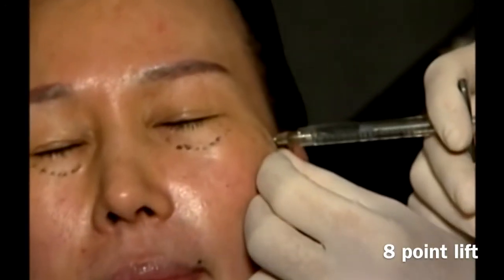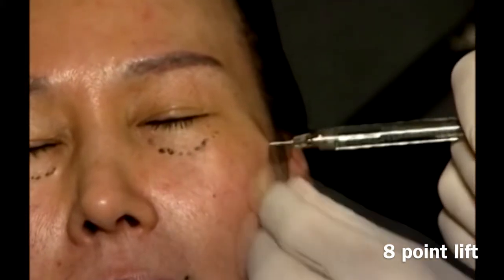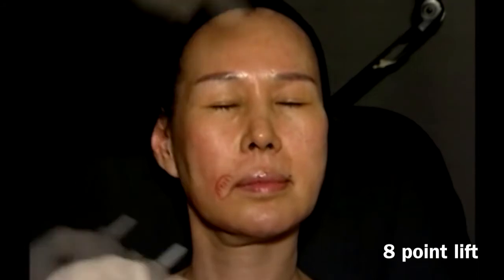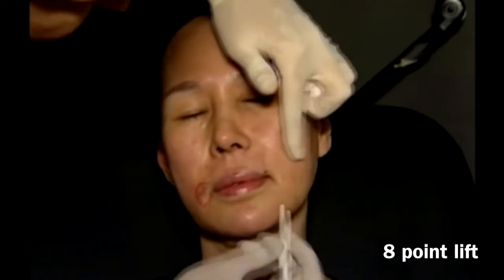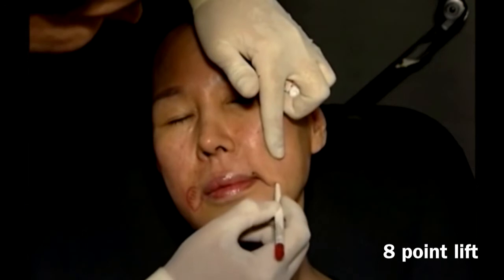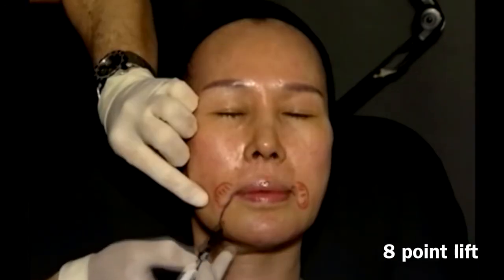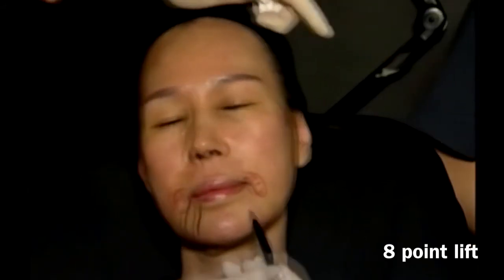The same is carried out on the left side. When we re-evaluate the no-go area, we may notice now, after the 8-point lift, that the skin sagging is minimal.